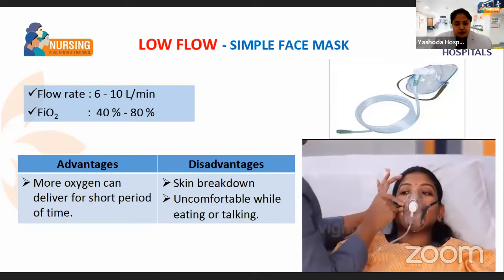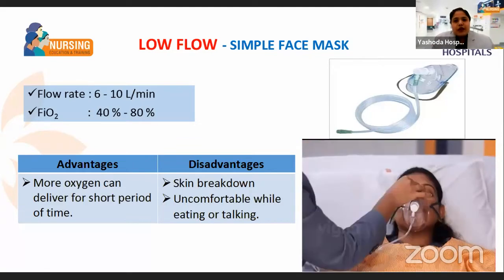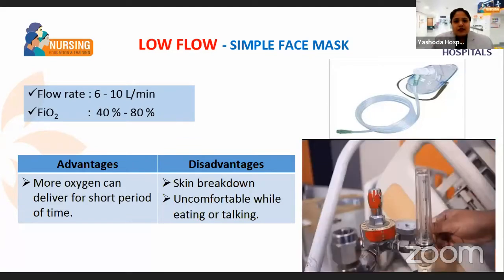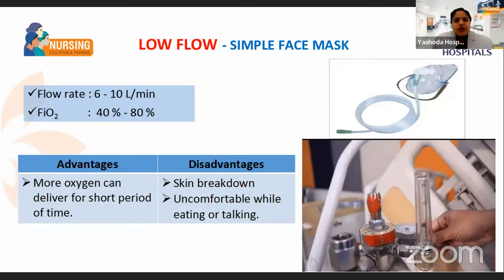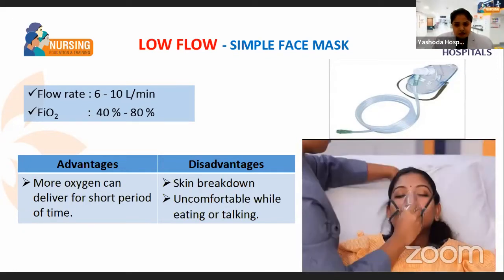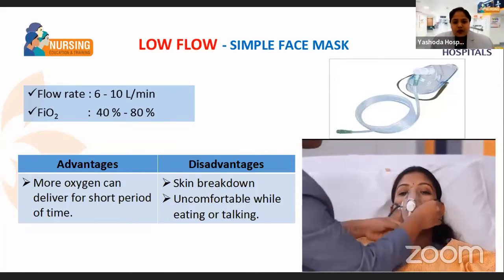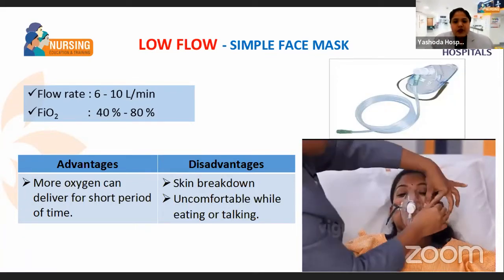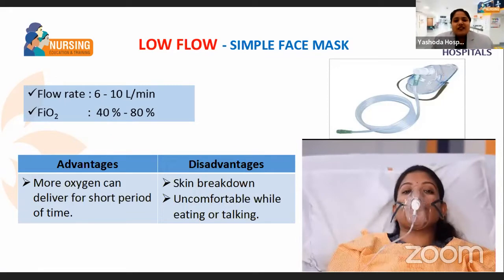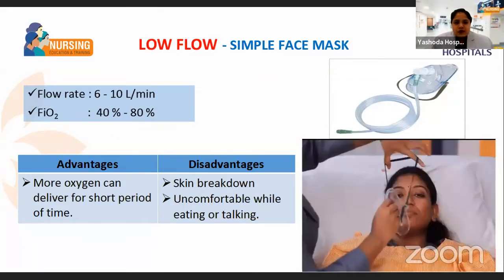So now it's time for a feed. What are you going to do with the patient? The patient is on a simple face mask and it's their lunch time. Then what will you do now? Anybody? Can I see the answers in the chat box? Okay, that's good. You need to place the patient on nasal prongs, then you can feed the patient.